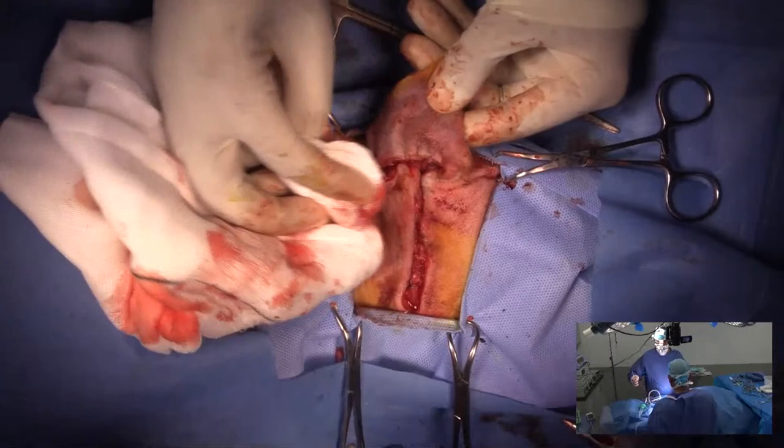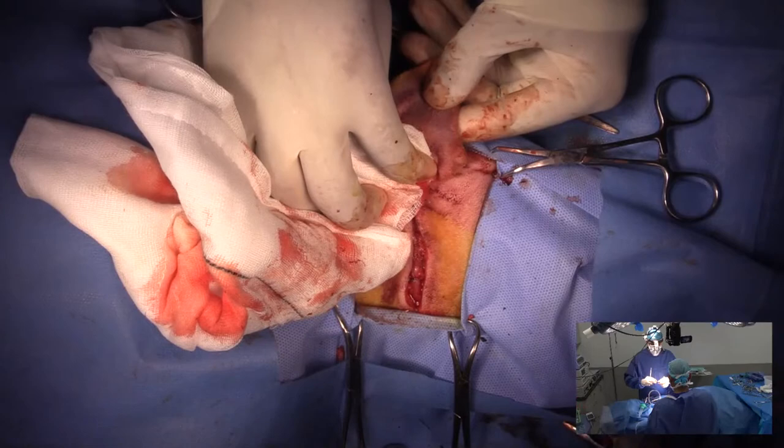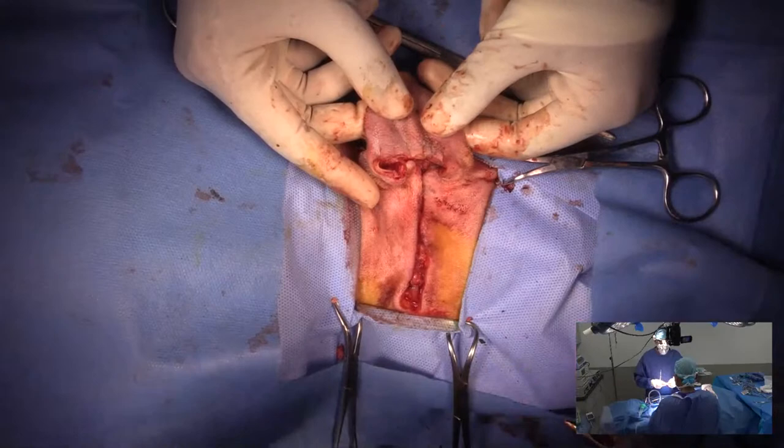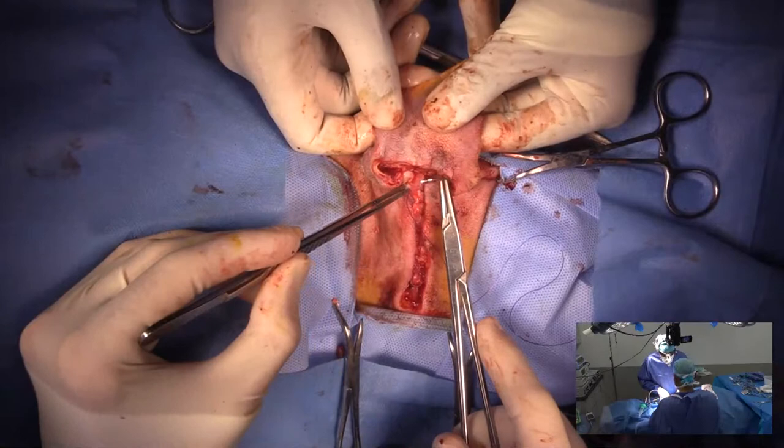The tympanic bulla is removed, so there's a question. In TECA surgery, the tympanic bulla is removed, and is that important? And it's absolutely critical. You cannot do a TECA without doing a bulla osteotomy. Otherwise, you will have really severe draining tracts develop and stuff. So that is an absolutely critical part of the procedure.